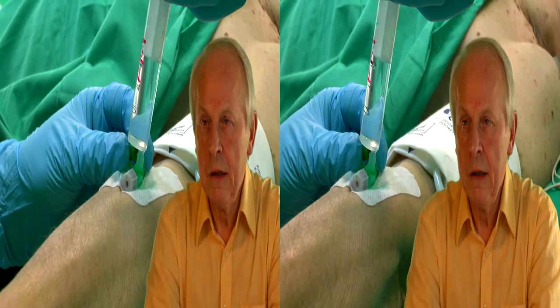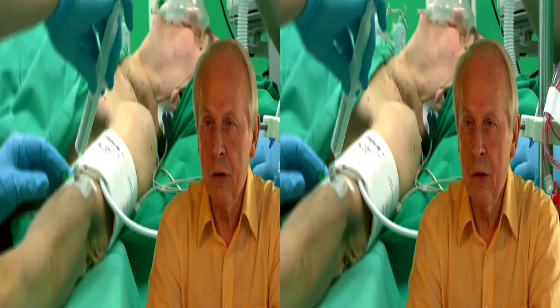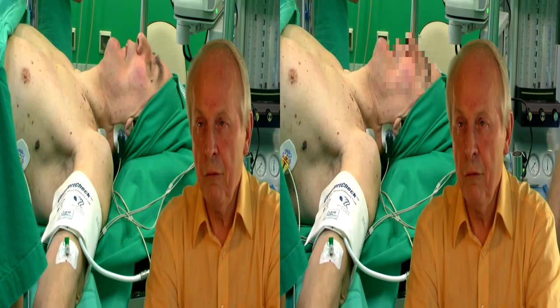Chory z chorobą wieńcową jest poddany operacji w znieczuleniu ogólnym wziewnym. Otrzymuje chory przed operacją premedykację, więc przygotowanie do znieczulenia. Następnie już na bloku operacyjnym taki chory zostaje zaintubowany, czyli rurka do oddychania zostaje prowadzona do tchawicy.